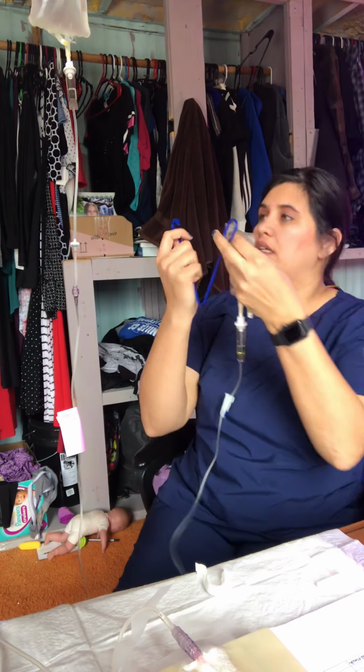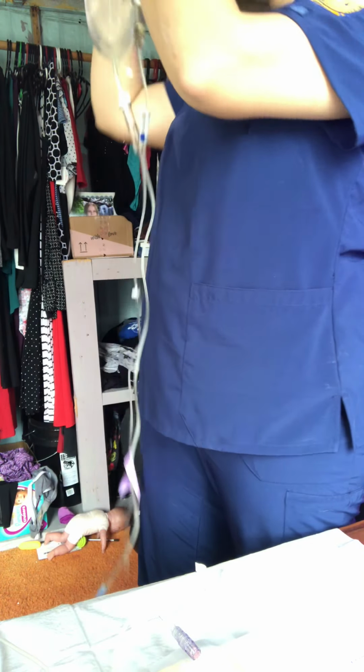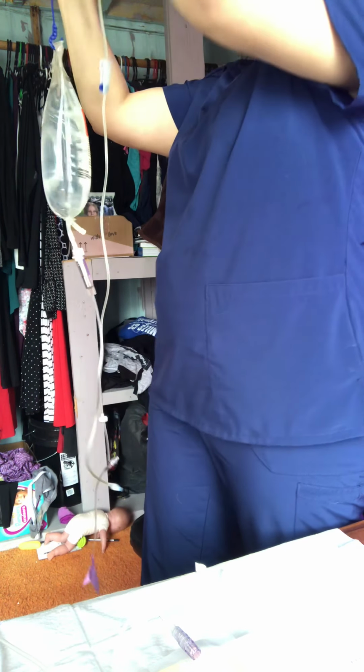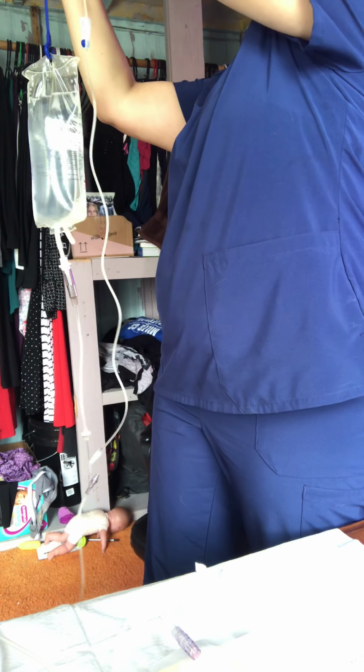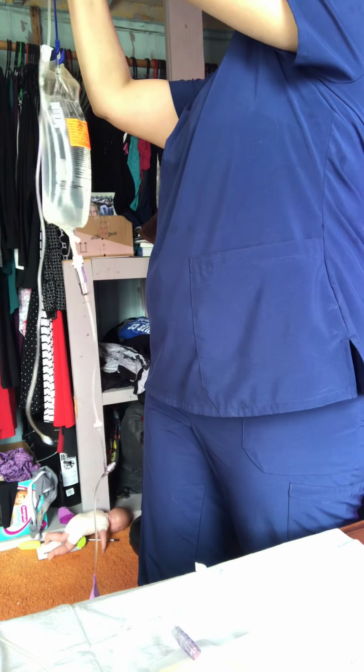Now I will take my Piggyback line and put it up higher than my primary line. There we go. So it's above my primary line. I am going to clean off this port with alcohol. Cleaned it off.